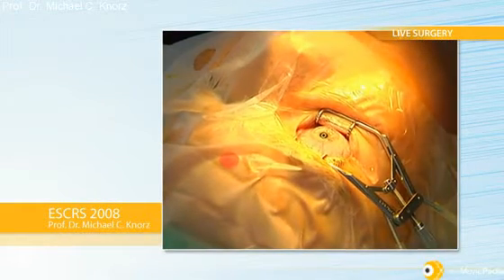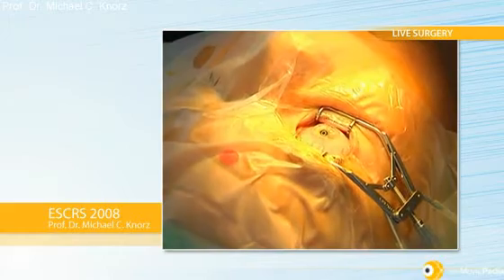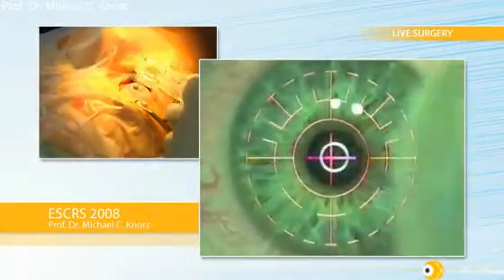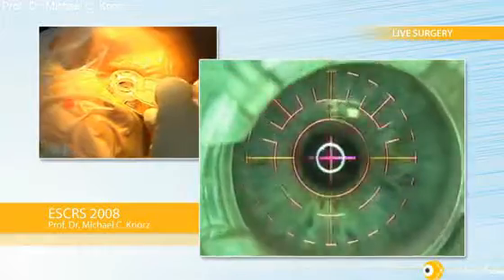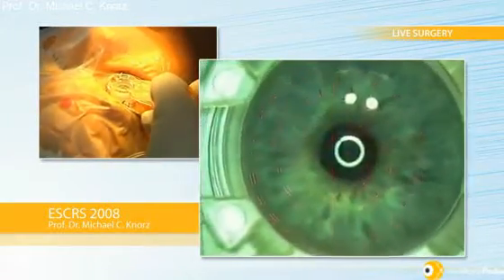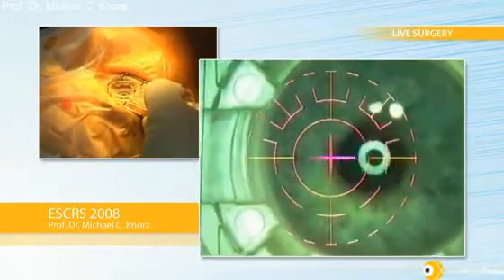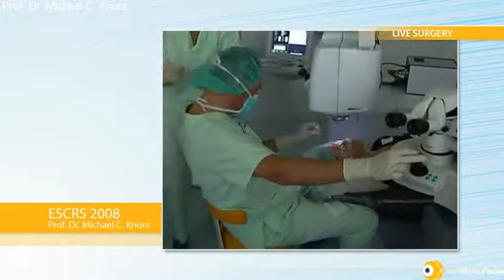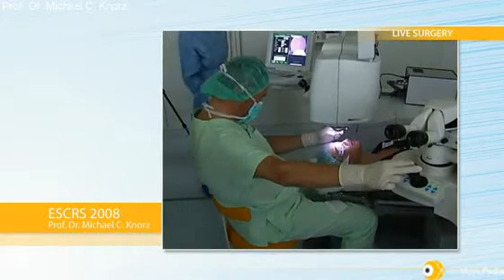Next I will place the suction ring. I like to do this under the Visex laser as well. I depress the syringe to four only, to avoid too much suction. I center around the pupil, press on the eye, and slowly release the plunger to avoid a very sudden increase of suction, which may cause some damage through the vitreous base.